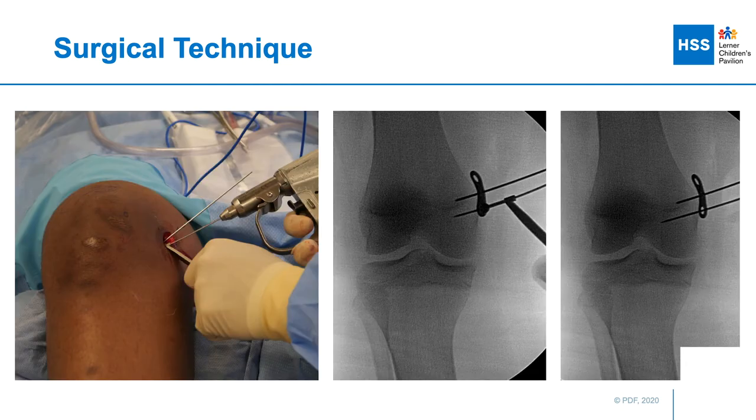At this point, we take a variable angle drill guide and place it in one of the holes — typically the epiphyseal hole of the plate — in order to rotate the plate to be in line with the femoral axis as seen on the lateral projection. We then use it to direct a guide wire into the appropriate position, and once it's down to the appropriate depth, I check a lateral view.